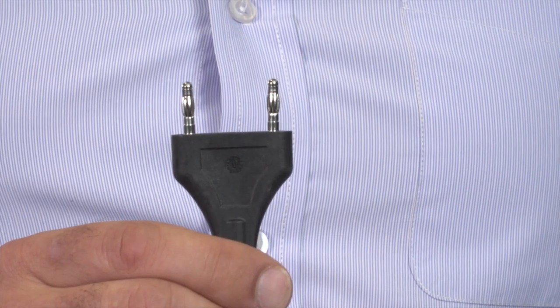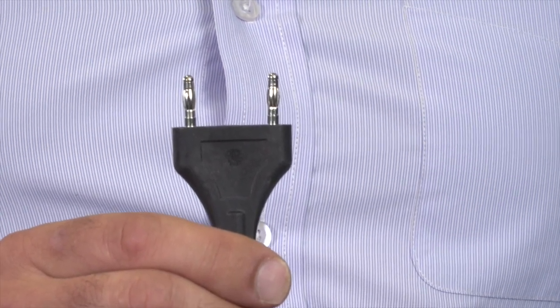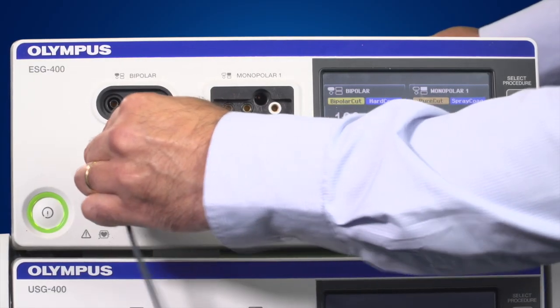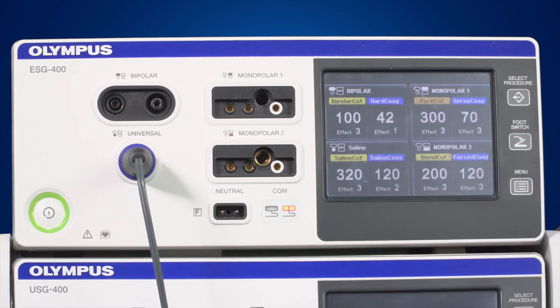Bipolar instruments have to be connected to a bipolar socket. The most common plug is the 2-pin international standard plug. The universal socket powers Olympus instruments — it has instrument recognition and stores information about the instrument. When connecting an Olympus instrument, the ESG400 may ask if you want to use the default settings. Click OK for default settings, Cancel to select your own settings, or make use of pre-selected saved settings.